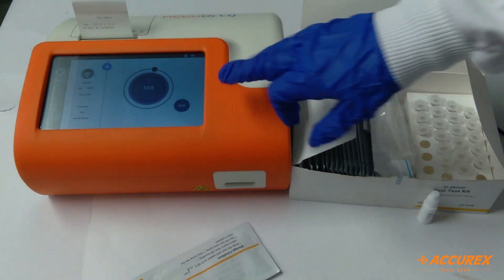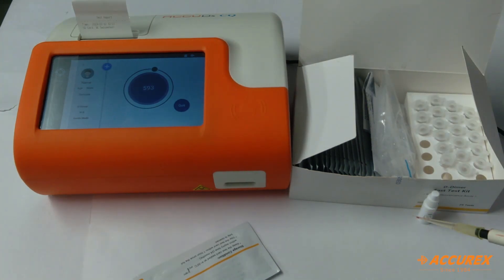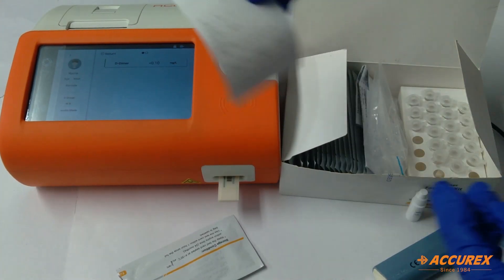It will take 600 seconds to give the results, so until then we'll wait. You can see the result on the screen and also on the printer paper.